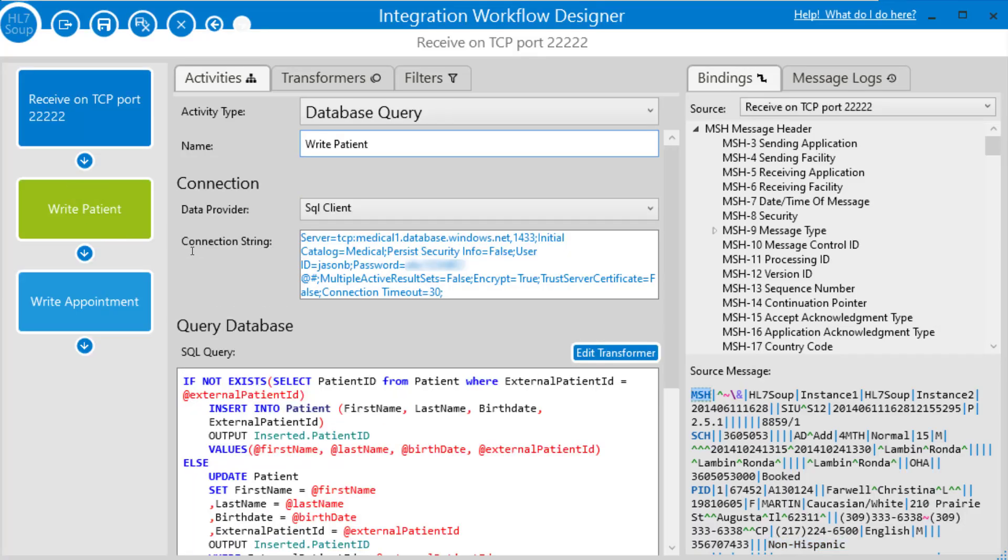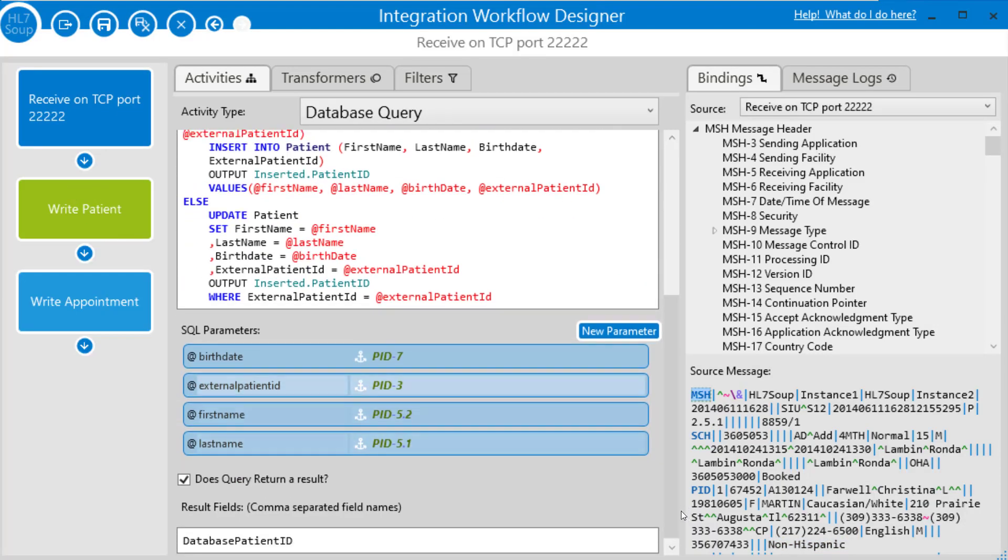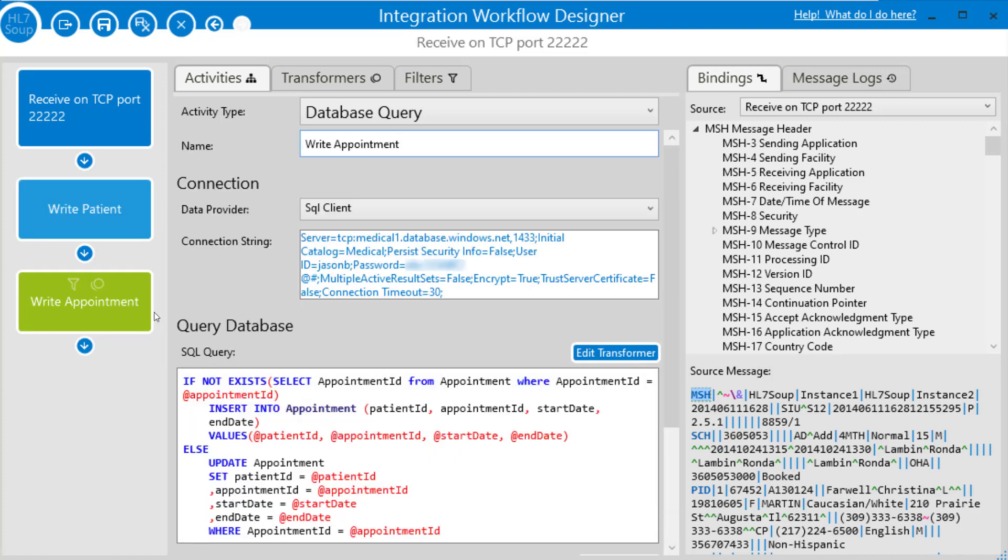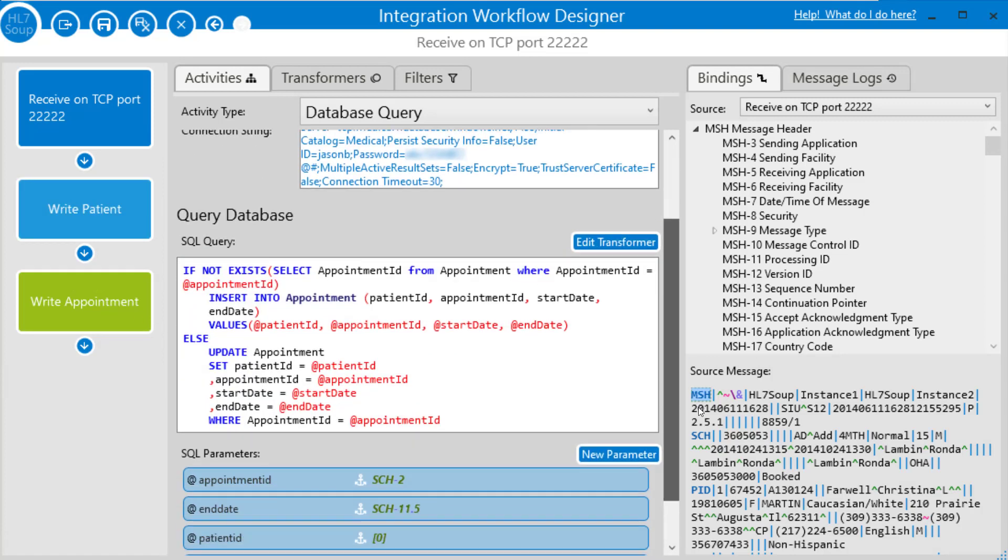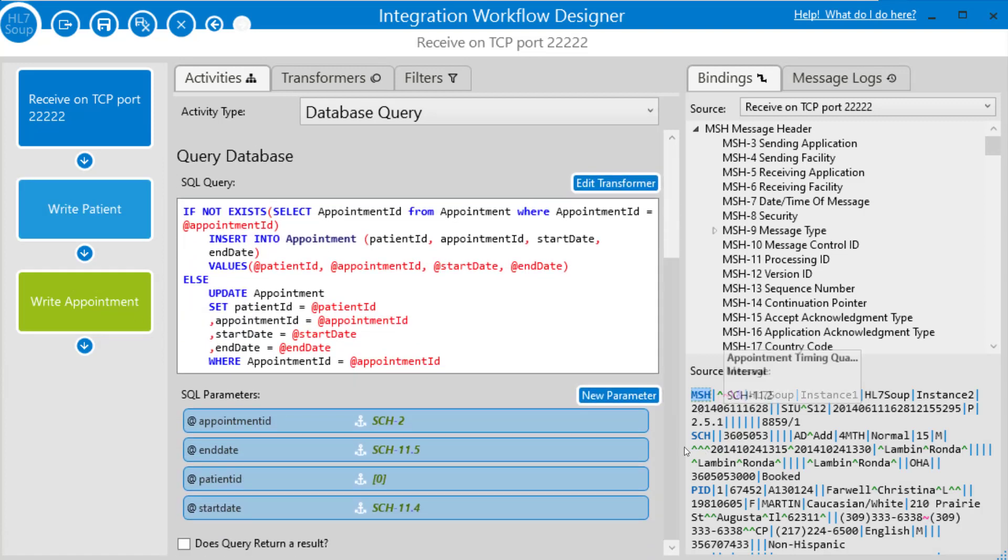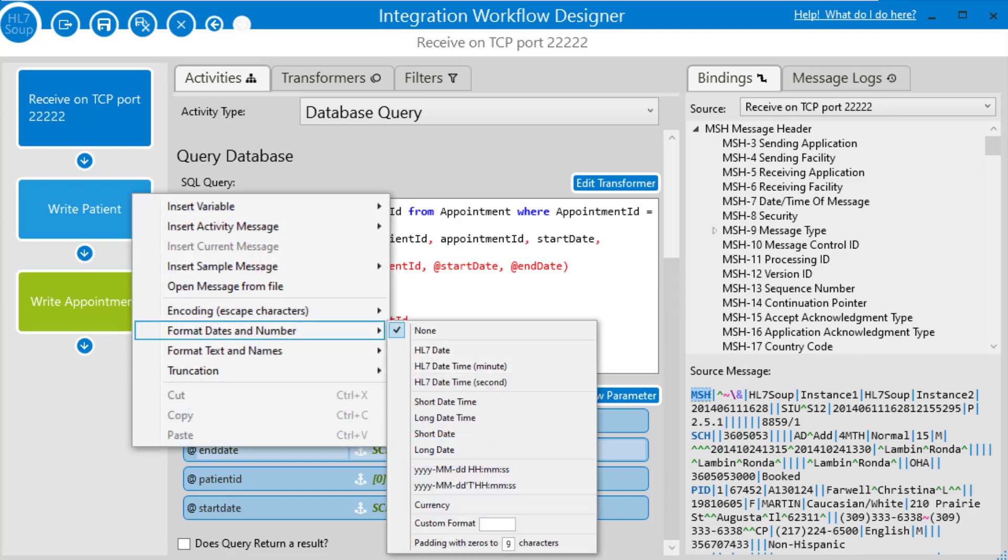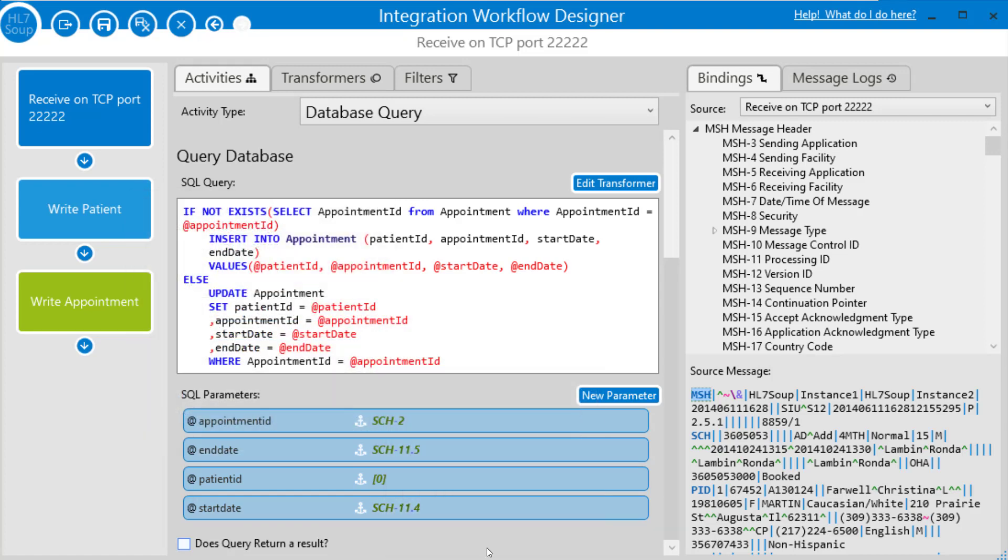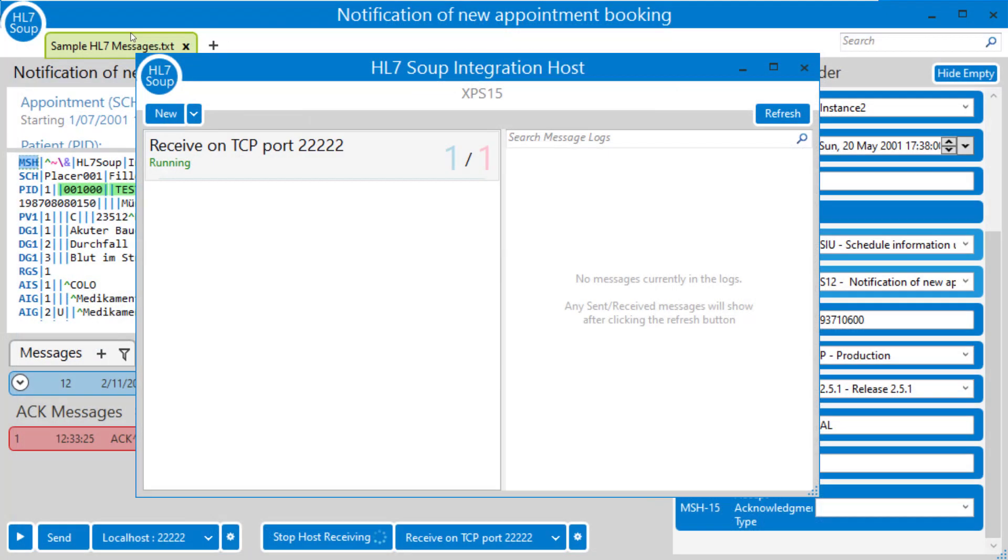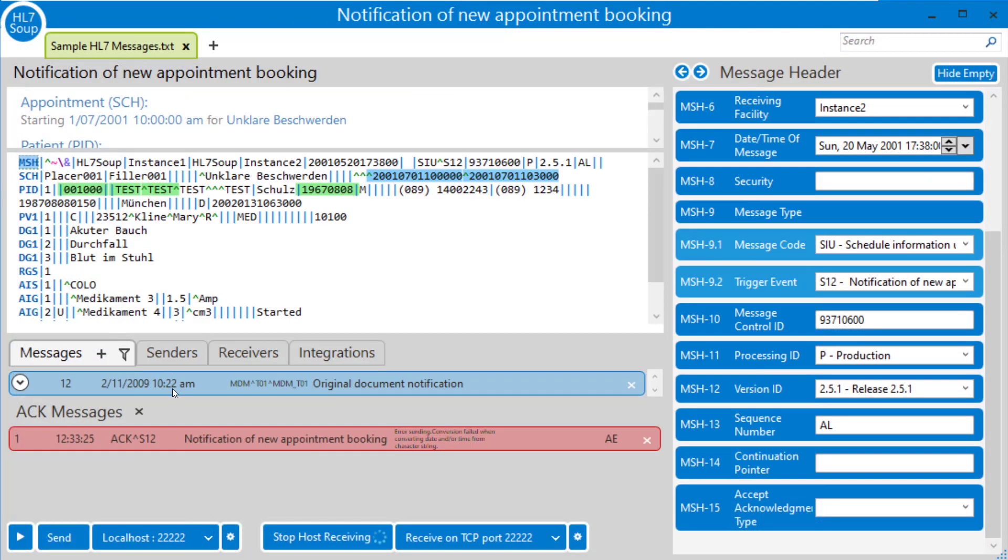Although we configured the date correctly for the birth date, we didn't do it for the appointment dates. So let me just go to the parameters here. And for the end date, format data number. Use our database friendly date format. And the same for the start date. And let's save this and retry again.